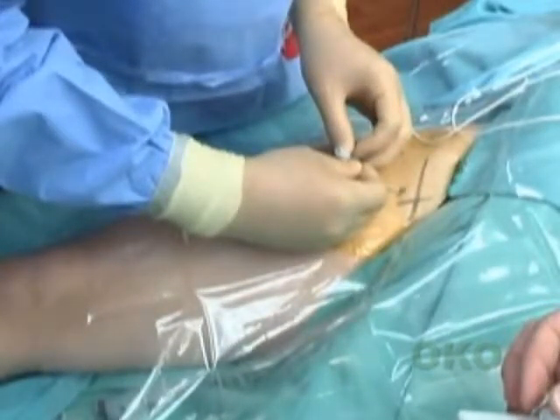The skin, subcutaneous tissue, and intended path for the tunneling of the catheter are anesthetized with lidocaine and 1 in 200,000 epinephrine. An insulated 17 or 18 gauge Tuohy needle is attached to the nerve stimulator, which is set to 1 to 1.5 milliamps, 2 Hz, and 100 to 300 microseconds, and enters the skin 1 sun, the width of the patient's thumb, lateral to the femoral artery, and 1 sun caudad of the inguinal crease.